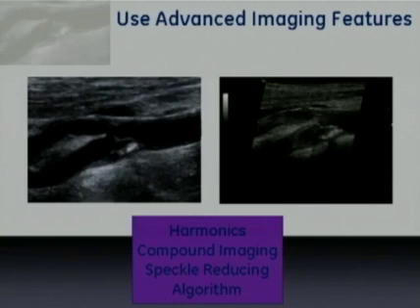And by making some of these adjustments, I'm able to see the flow and really understand the hemodynamics that's occurring and appreciate how tiny this jet is and this tiny residual lumen on this very short segment stenosis. So sometimes understanding how to manipulate the controls on your particular ultrasound system can really make a difference in the image quality in certain pathological situations.